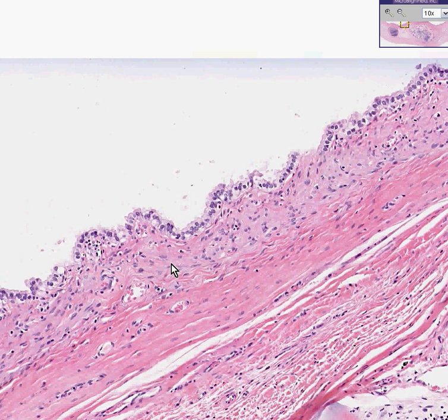This is a benign teratoma. Teratomas are much more likely to be benign in the ovary than in the testis. A good general rule is that most teratomas of the testicle should be watched much more closely than those of the ovary. A young woman with a dermoid cyst — a benign cystic teratoma — you normally don't worry about too much. In the testicle, however, even if everything looks nice and benign and mature, teratomas are viewed with much more caution.